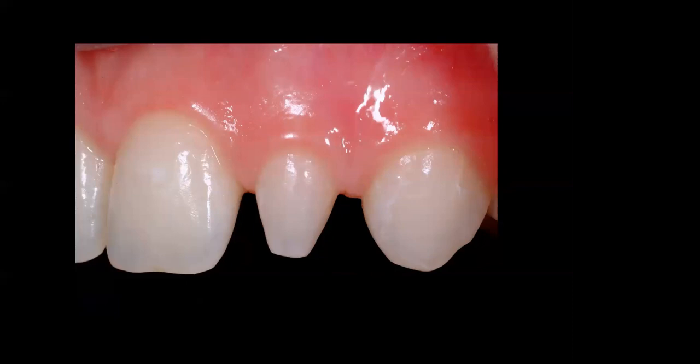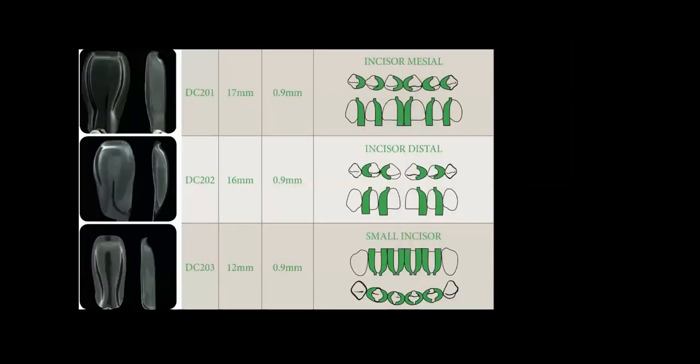So you could do this case a lot of ways, but I'll go ahead and tell you what I did. I got started on the case. I looked at the space, especially here. I said, nope, we're going to do all six of the anterior teeth, because not only did the patients want to have the space closed, they did not like the gray incisal edges. I know that for many years, people thought that doing translucency and layering for translucency was exciting, but most patients really don't like the gray tooth. Why do people bleach their teeth? Because they want them to be more opaque and they want them to be bright. So these are the matrices that I used in the case.